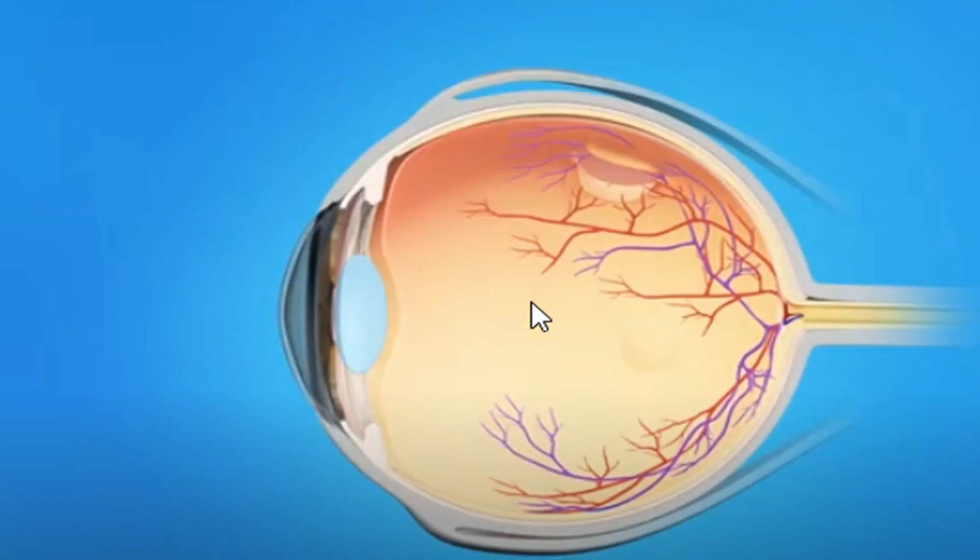Let's see the other school, when we no longer have accessibility. This is the retinal tear, the same tear as above. So what are we using? We can't access it from here. Maybe you have hemorrhage, trauma, whatever. You have a small pupil that can't be dilated. You can't pass the laser from here, and you can only see this side clearly. Or maybe the tear is not here; it's anteriorly, so you can't see it because you only see in a straight line. You can't have this turned picture.